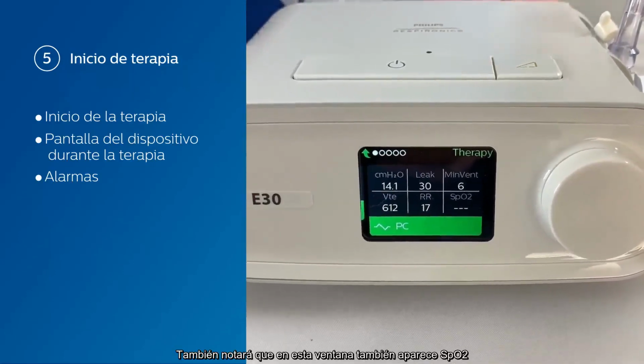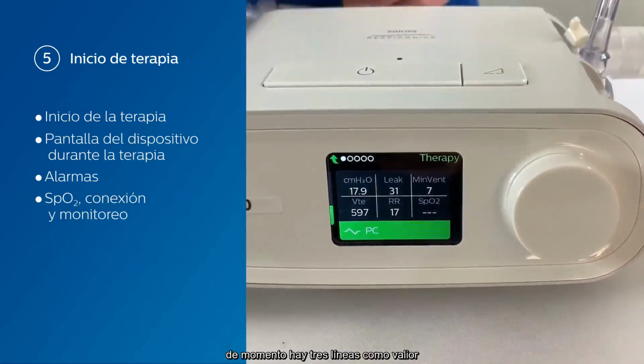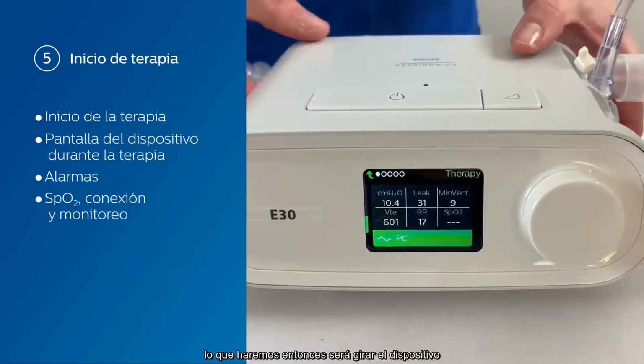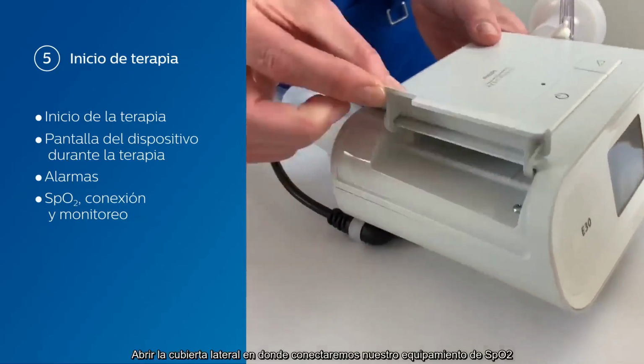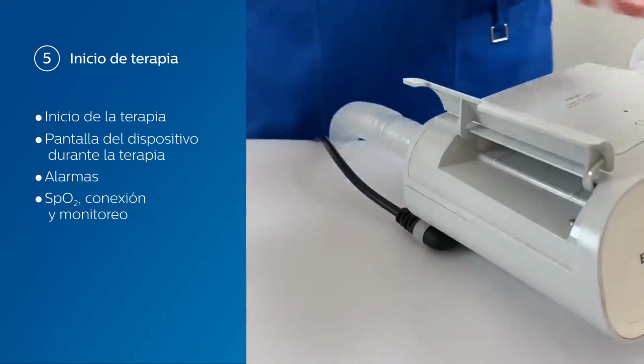You'll also notice on the screen that there is an SpO2. At the moment, there's 3 dashes, and that's because we don't have our SpO2 equipment connected. So what we are going to do is rotate the device, open up the side door here, and connect our SpO2 equipment.